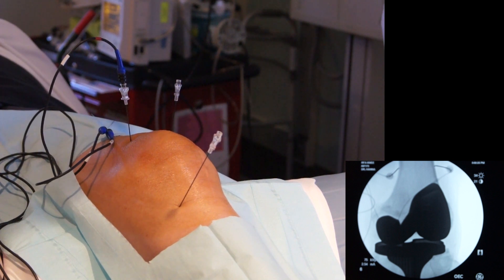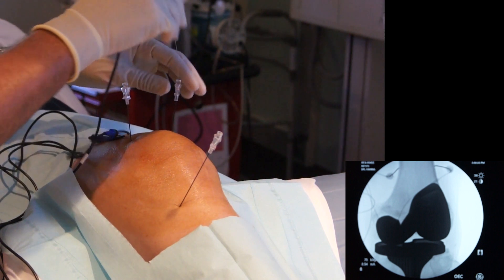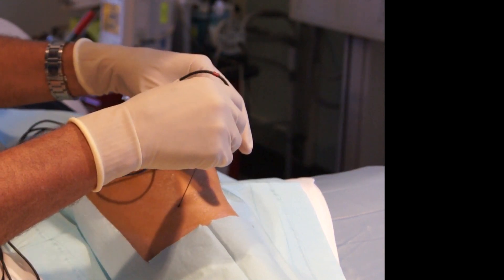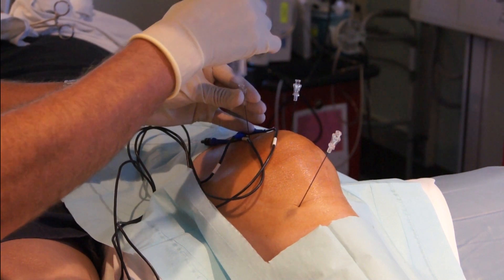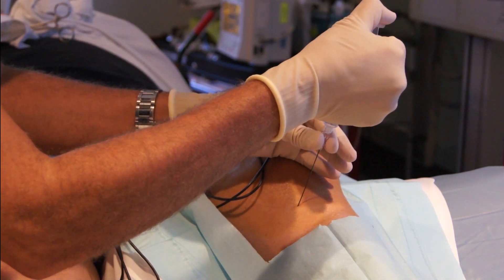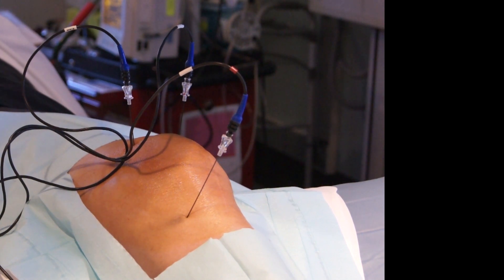We are doing stimulation and we are not getting any motor stimulation, so we are going to move on. After numbing the nerve, we wait about 30 seconds to a minute until the nerve is numb, and then we are going to perform the radiofrequency ablation.